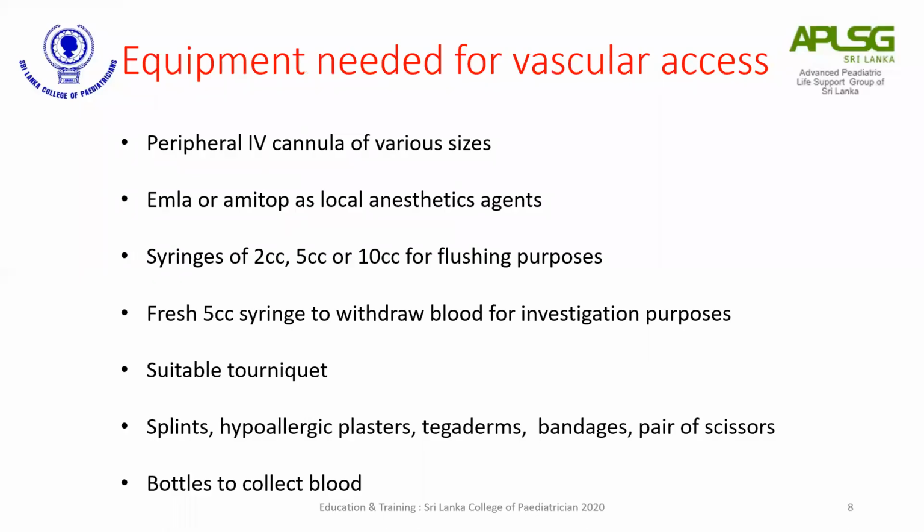Then different sizes of syringes for flushing purposes as well as doing blood investigations. A tourniquet, maybe a splint, plasters, bandages, and of course, bottles to collect the blood. So keep everything at hand before starting the procedure.